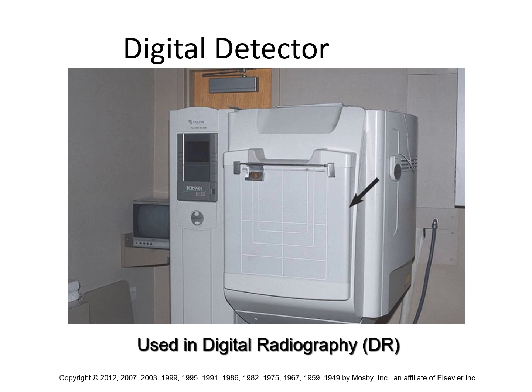Okay. So this is our digital detector. Now, first generation stuff was actually hard tethered into a vertical bucky apparatus or integrated into a table. But they quickly found out that that means that they had to build 2 detectors for each machine, and then they reverted back to, okay, let's make it like a cassette where it's wireless and a single detector can be put together and just can be moved around by the technologist.